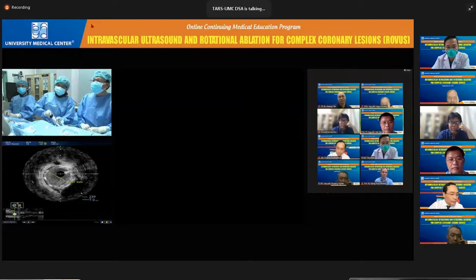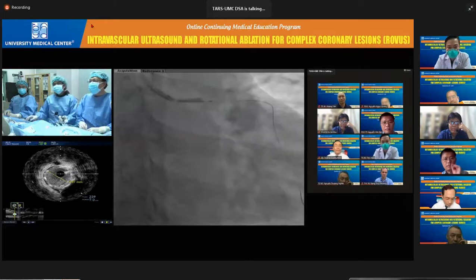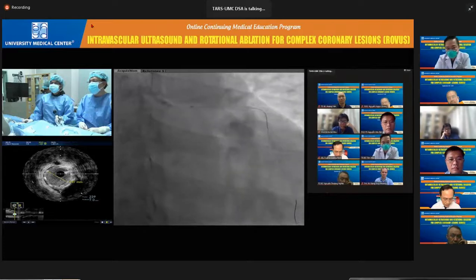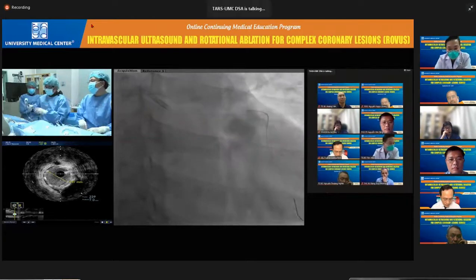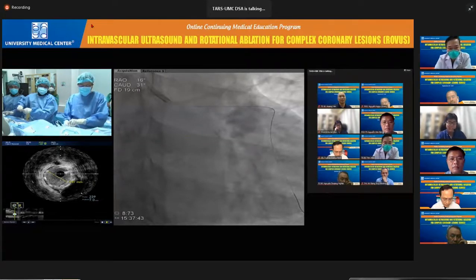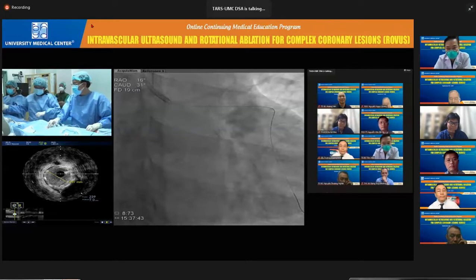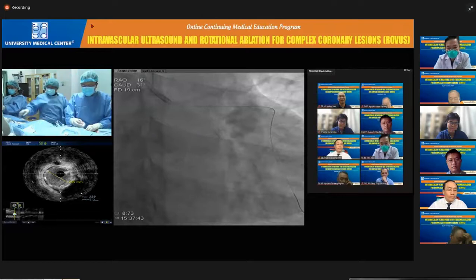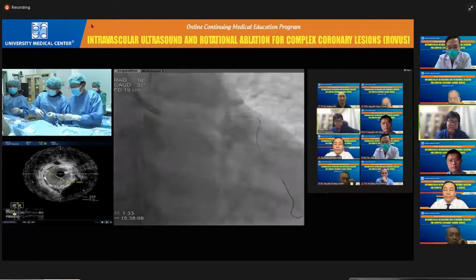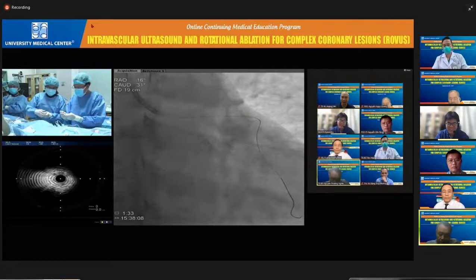So the most important key point in the DK crush is that after we use a balloon to cross the circumflex stent, we must make sure that this is the complete crush. So Dr. Kuramitsu, can you share some experience about how to do the complete crush for the DK crush technique? Thank you, Dr. Wu. So actually, DK crush is not my favorite technique.